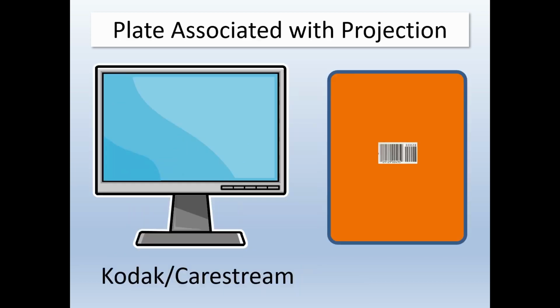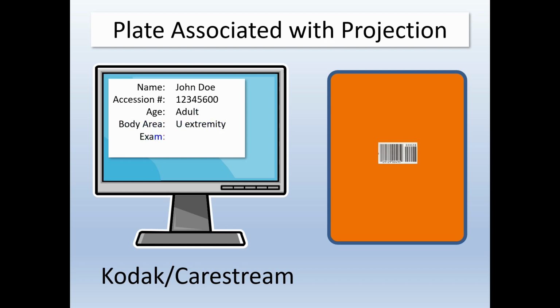There are two association methods common in radiography. The first employs a barcode on the imaging plate that is visible through a window in the back of the cassette. The patient data and view are called up on the computer screen, and the radiographer uses a scanner to read the barcode, and the cassette with the ID code is associated with the PA projection of the hand for the patient John Doe. When the plate is removed from the cassette and read, the image will be sent to John Doe's exam and the image corrected using adult hand correction factors.